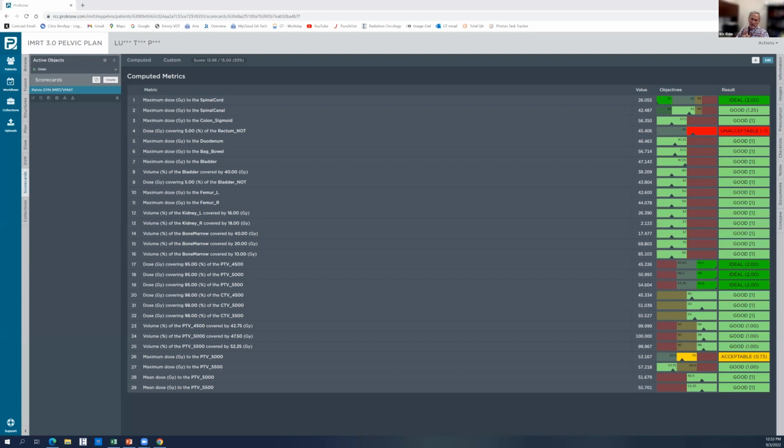If you have the choice between a 3D and a VMAT or an IMRT, and you as a physicist have that choice, you're always going to want to shy towards the VMAT or the IMRT, because it's so much easier to do the inverse plan versus the forward plan. Not to mention the techniques of doing a 3D head and neck, I remember those days, and they were tough. You have to come up with some way to boost the nodes over the cord, and you do a posterior cervical electron strip. You'll save yourself so much effort by going to IMRT or VMAT.